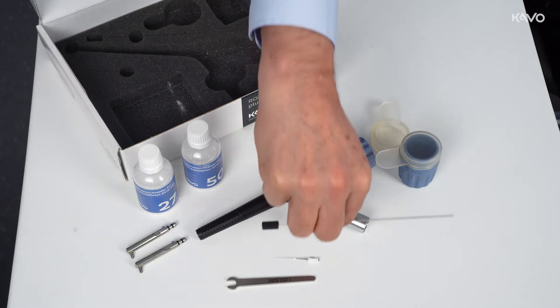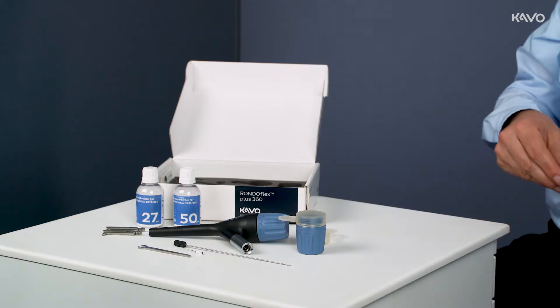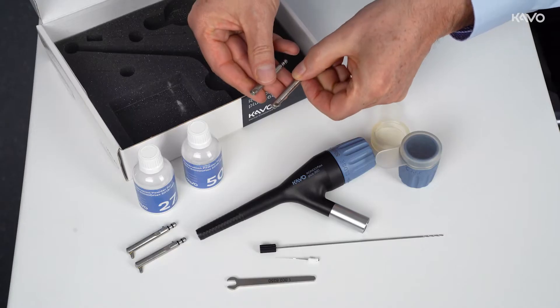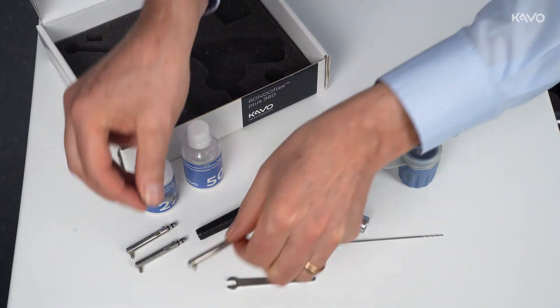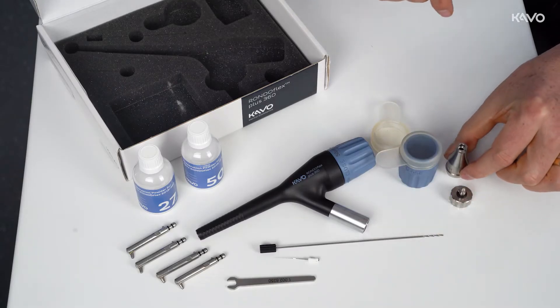If the base body is clogged, the nozzle tube can help. Optional accessories include canulars for the various powder sizes with a 90 degree angle for obtaining better access to the molar area, as well as the cleaning adapter and the safety glasses.